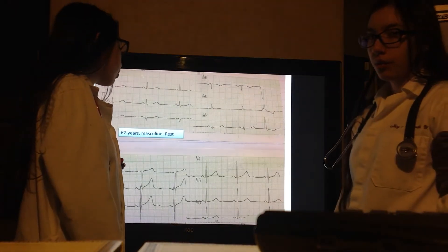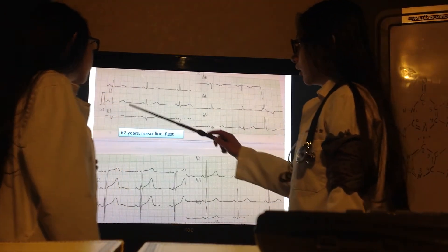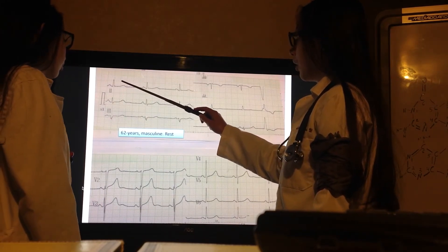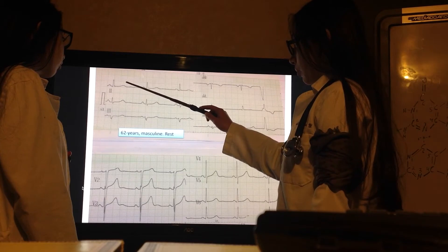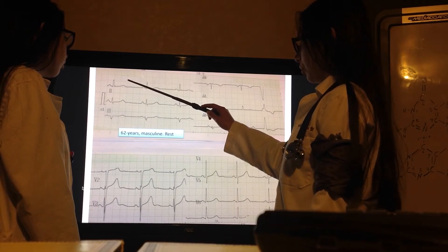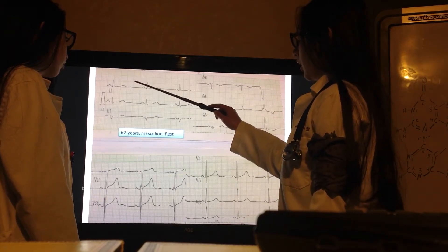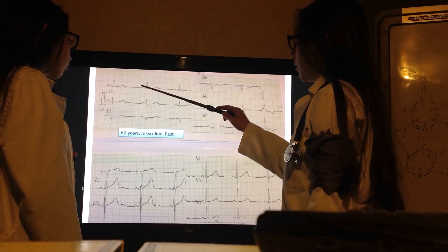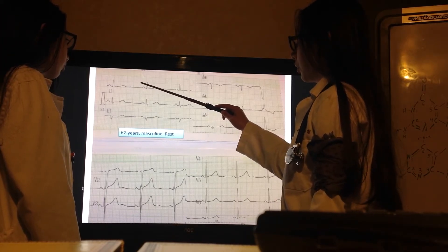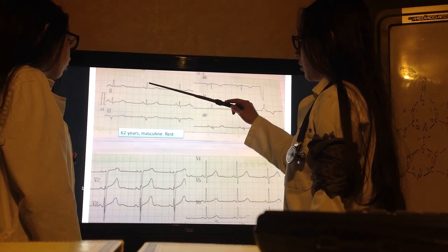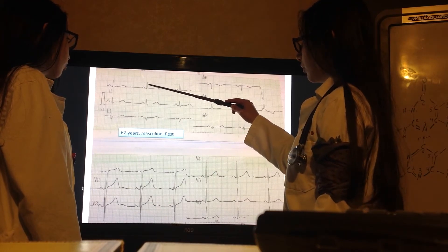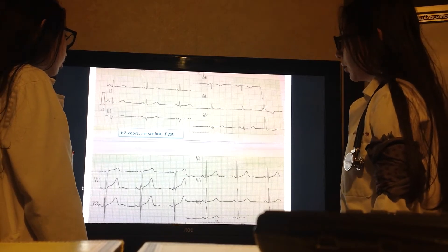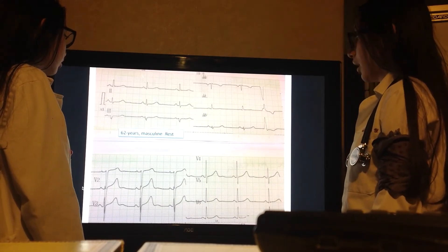We are going to begin with the frequency. If the next beat would have been here, it would be 300 over 1; here, 300 over 2; here, 300 over 3; here, 300 over 4. And it's here, so it's 300 over 5, which equals 60. It's a little less than 60, so it's bradycardia.